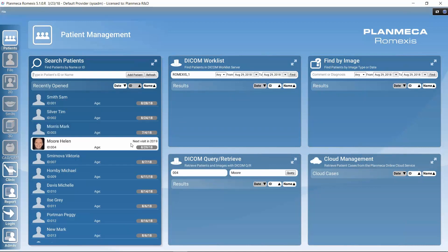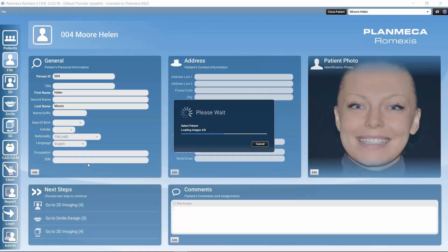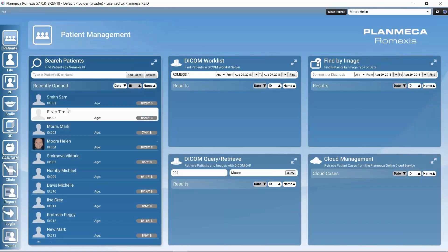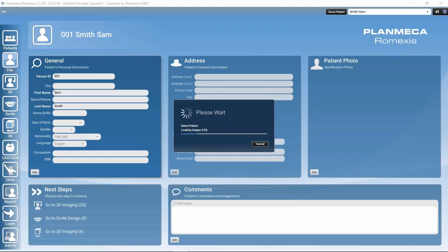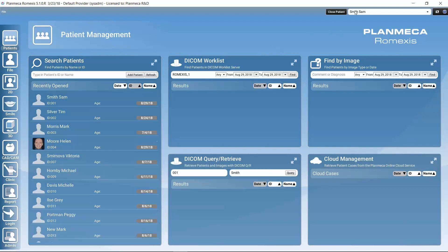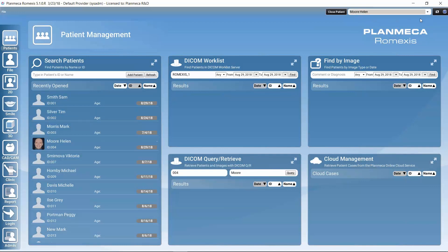We can have multiple patients open at the same time. From patient management, open one patient, go back, and open another. In the upper right corner a dropdown shows all currently opened patients, and we can toggle between them by clicking the name. It's important to always verify you're working with the correct patient when capturing images. Patients can be closed individually from this dropdown.